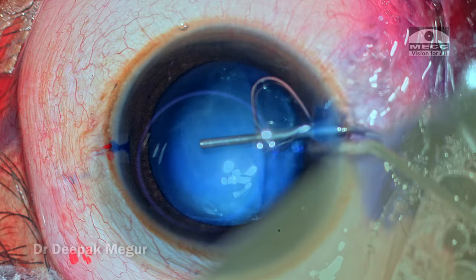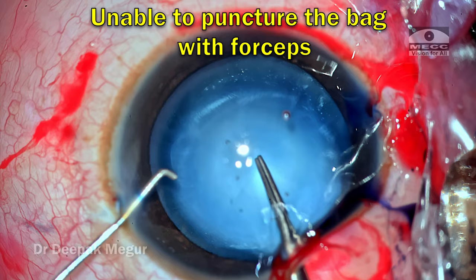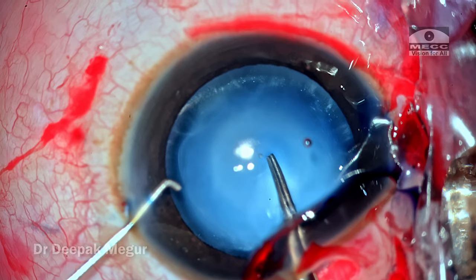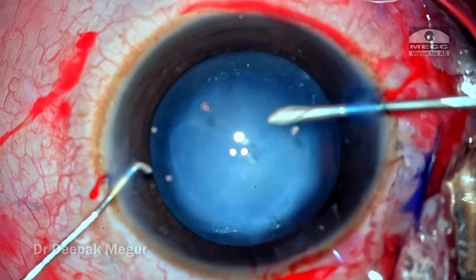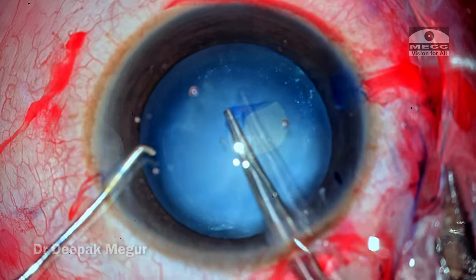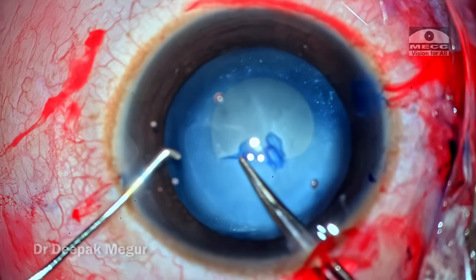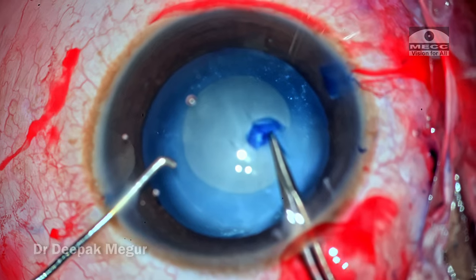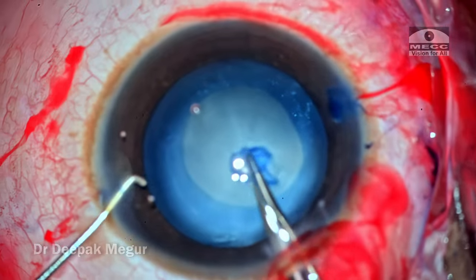The incisions are created, the anterior capsule is stained, and it is time to perform the rhexis. I am finding it difficult to puncture the anterior capsule with the forceps, which raises some suspicion. I reverted to my 26-gauge needle to puncture the anterior capsule, and then performed the rhexis with the forceps. The most important step in this surgery is the rhexis, as in most pediatric cataract surgeries — we need to get it perfect because in-the-bag implantation and a well-centered lens is absolutely critical.